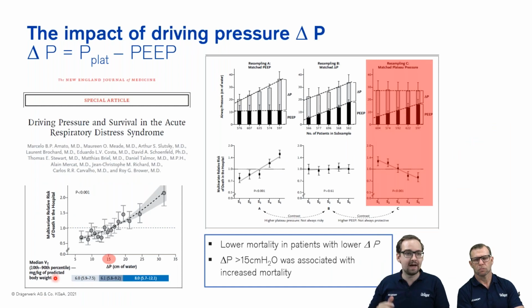Maybe we dive in and start with the driving pressure. Here you can see this study from Marcelo Amato, which looked at driving pressure and survival in ARDS. In this analysis, he was looking at different combinations of driving pressure: keeping the driving pressure similar, increasing driving pressure, or even lowering the driving pressure. This is what you see up here.